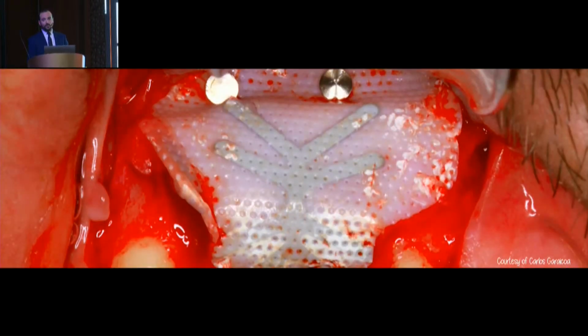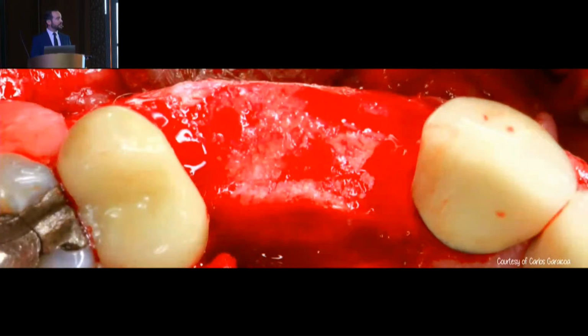We reopen the site. What do we want to see when we reopen a site? We want to see our push pins and our membranes in the exact same position that we left it 6 months ago. So if we see that, what we are going to see underneath is obvious. We're going to see a nice bone volume that we were able to regenerate.